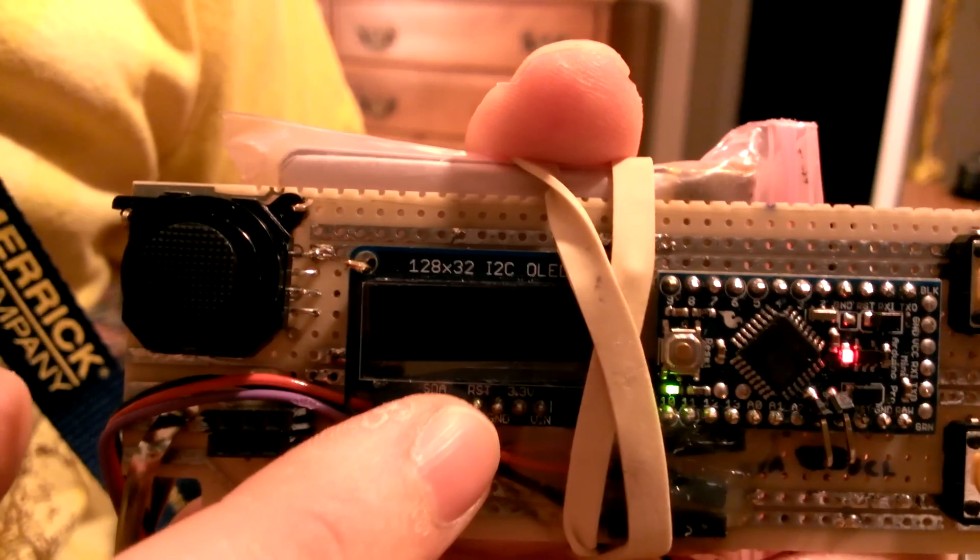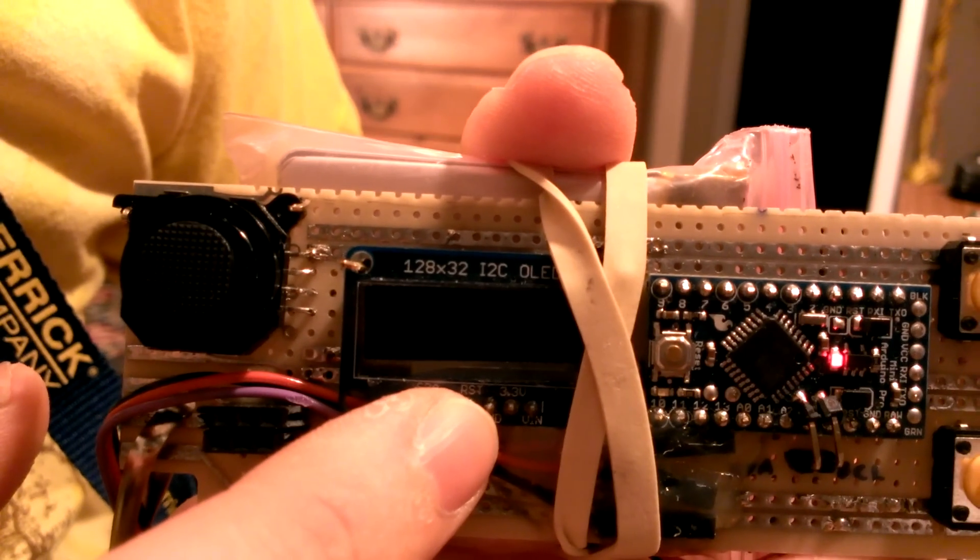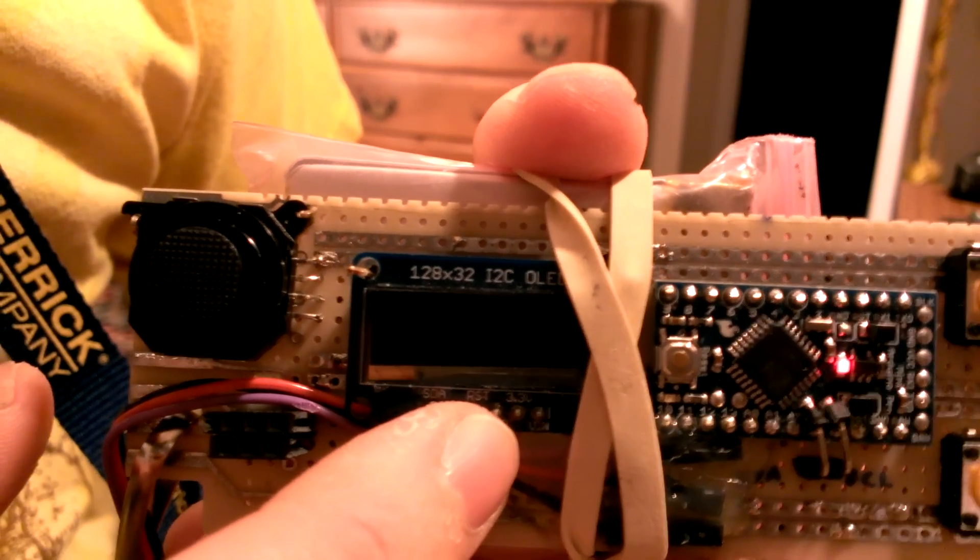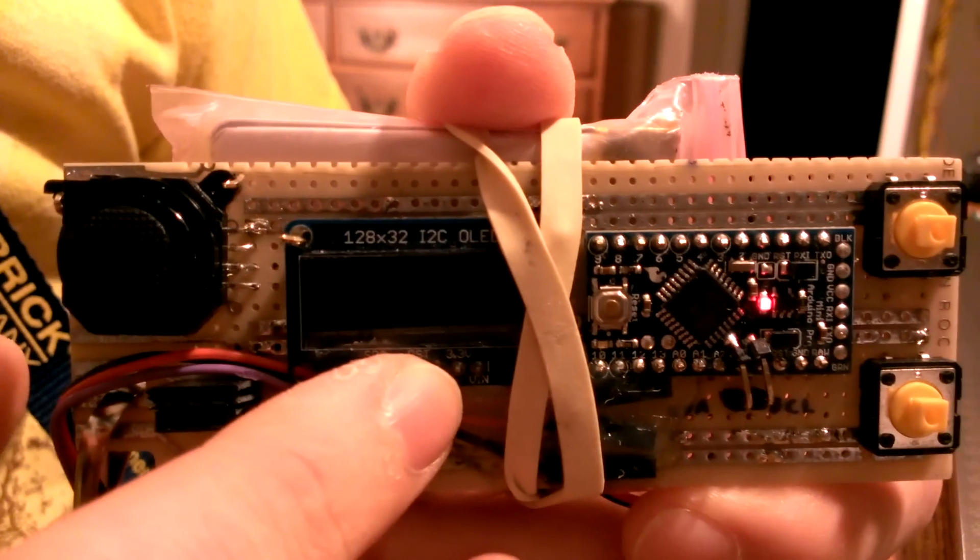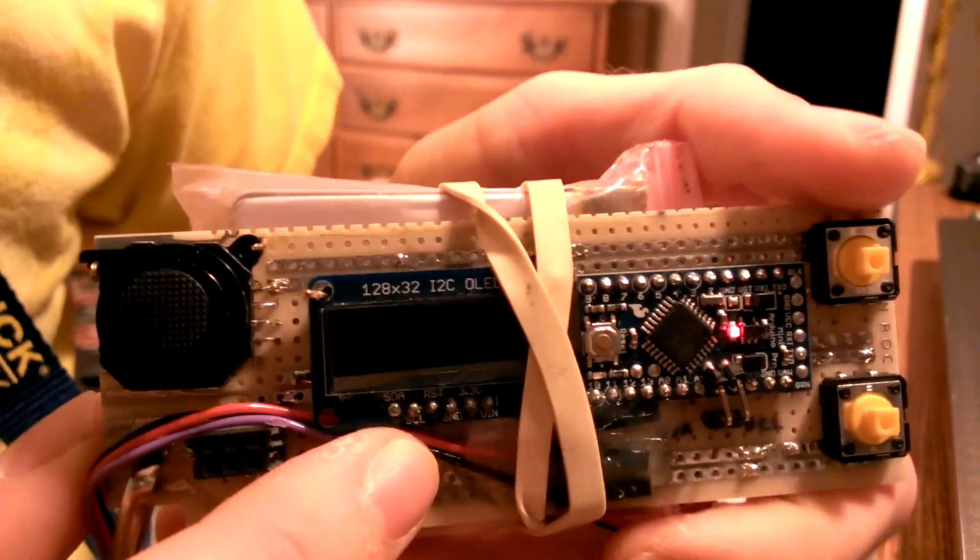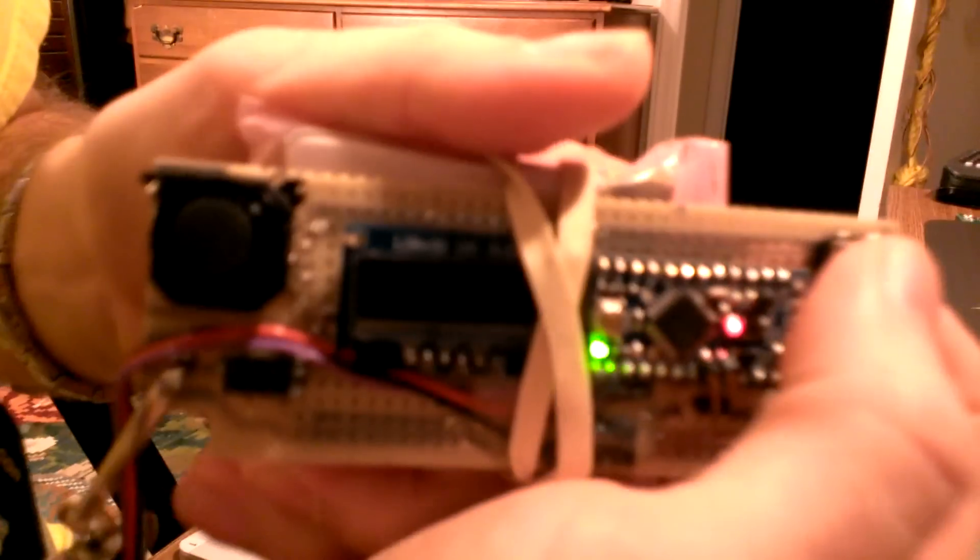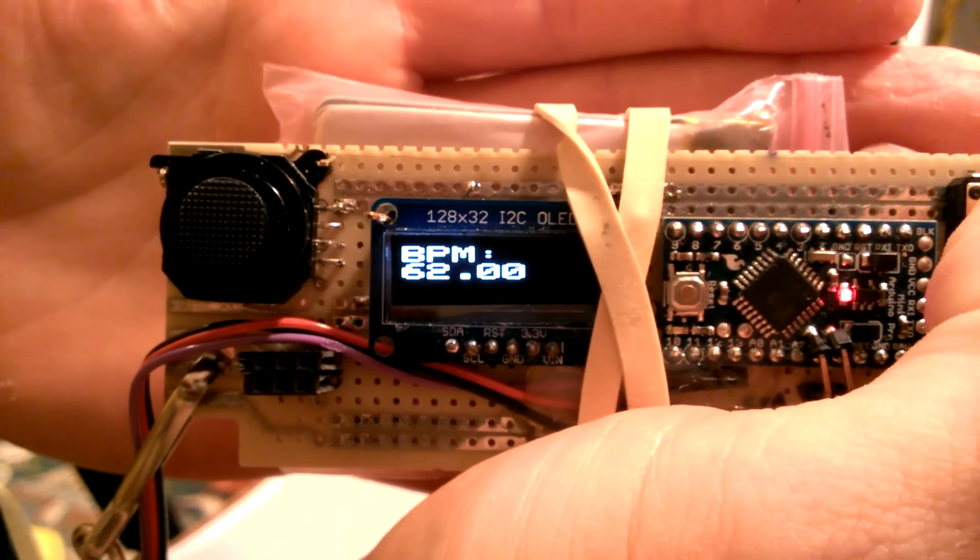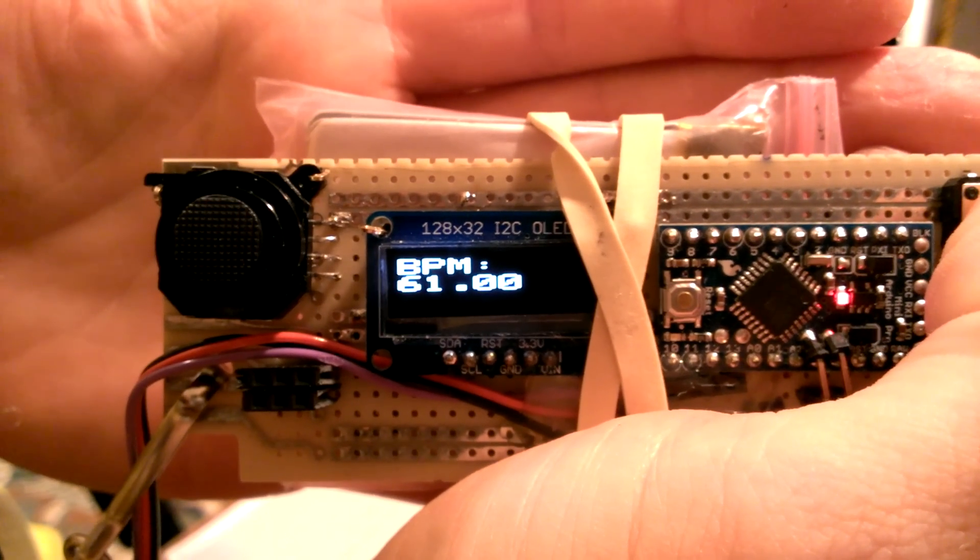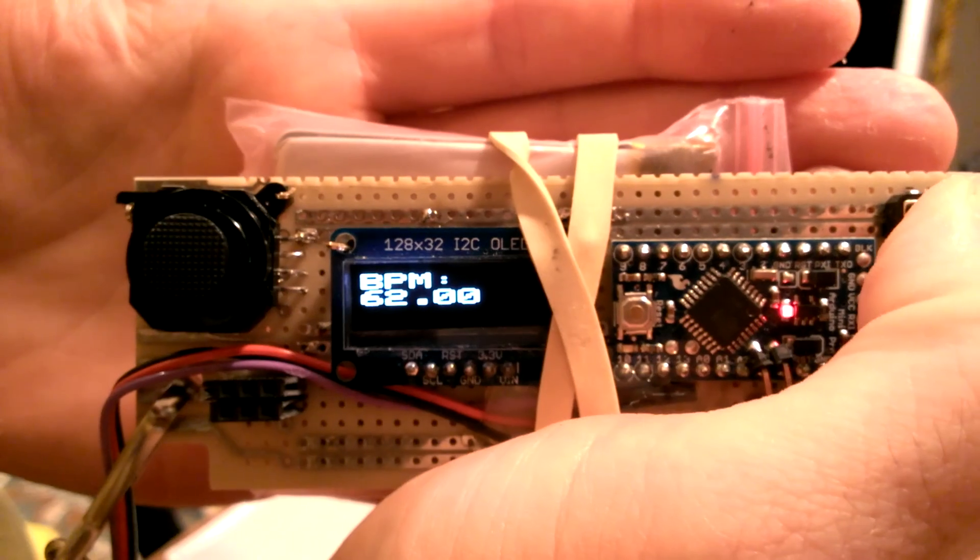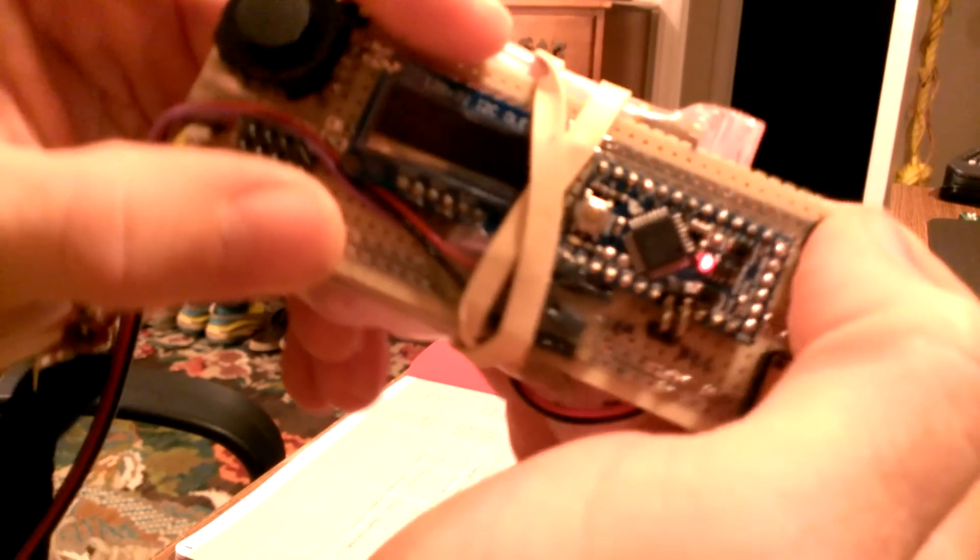And you'll also notice that no data is being displayed right now. That is because I chose not to have the data displayed all the time, only whenever you press the button to save power. So I'll do that now, I'll push the button. So I can get it to zoom in. So right there is my current heart rate.